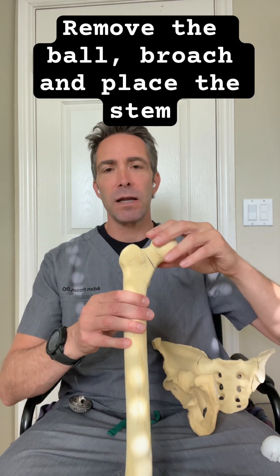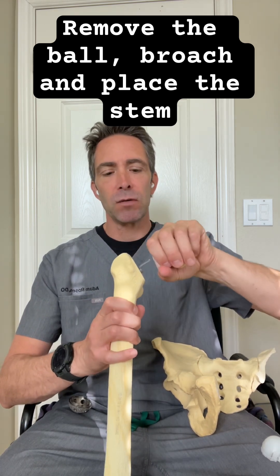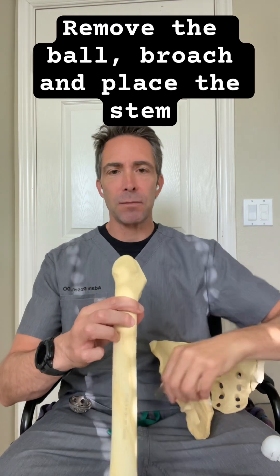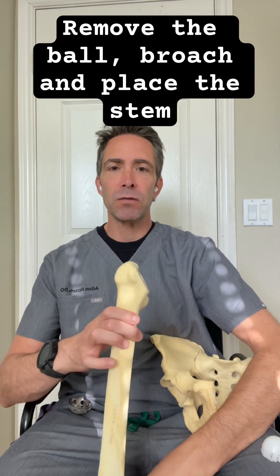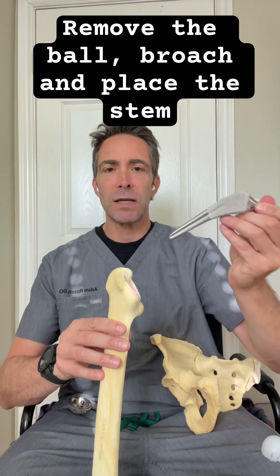The next part of the operation is on the thigh bone side. Once that head is removed, we can make a cut along the base of the ball to actually remove the ball from the top of the thigh bone. And then what we do is prepare the inside of the thigh bone, or the inside of the femur, to accept an implant.